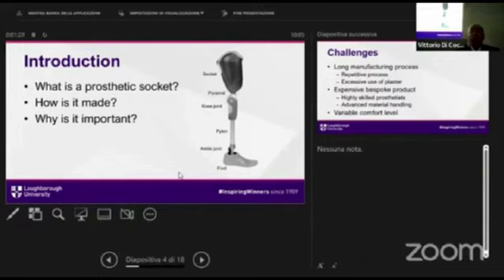And to get the idea about the modern challenges, let us consider that this socket, which is presented here, is being made of either metals or nowadays polymer-based composites. It is 5 orders of magnitude stiffer than the soft tissue. And inside the soft tissue, there is a bone, which is also of the same orders of magnitude stiffer. So we have a very short transition between these two materials, and the mismatch is a very significant one.